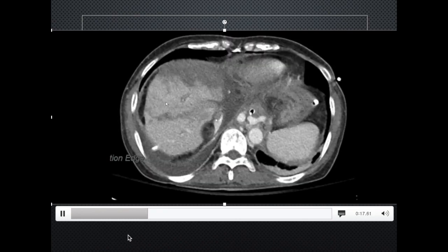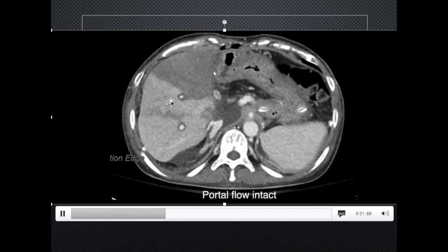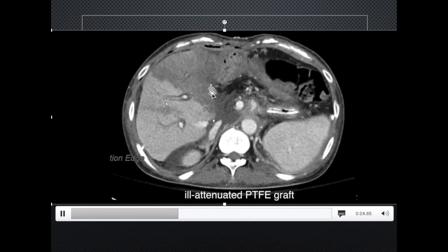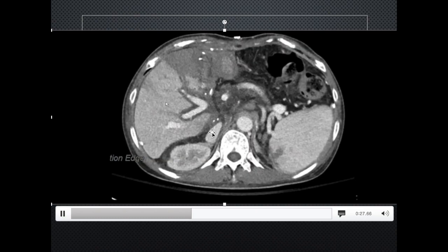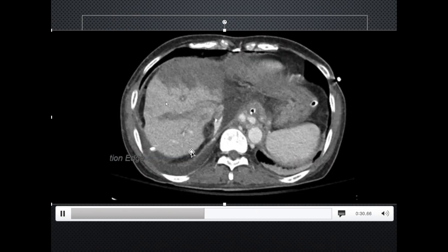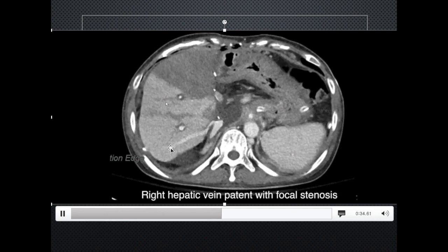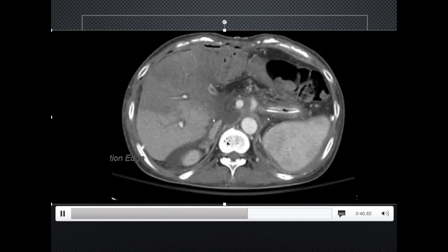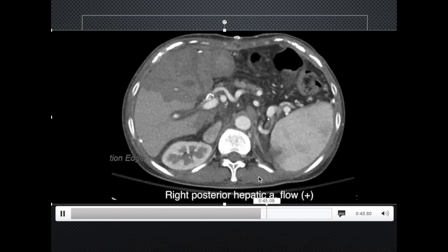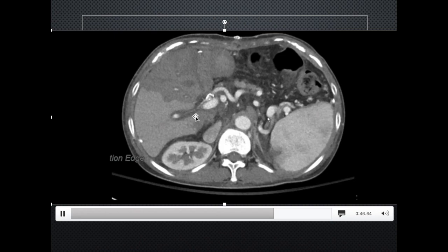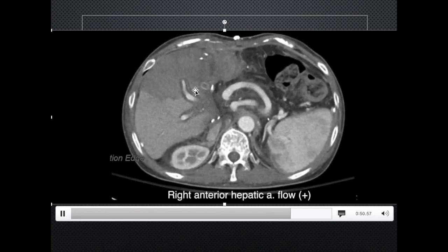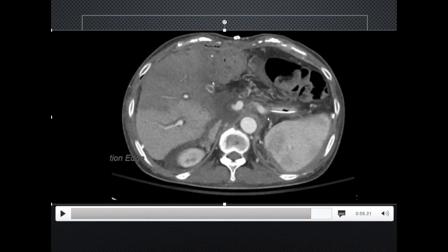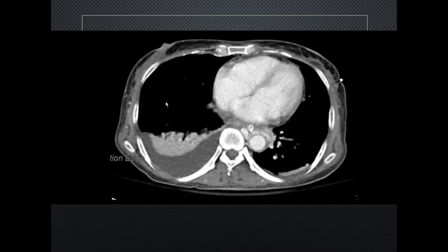Now let's take a look at the vasculature. The portal flow seems okay and intact, but compared to the bright portal flows, the PTFE graft shows ill-defined attenuation. Going up to the hepatic vein, the right hepatic vein shows some patency but there is some stenosis. In the arterial phase, we can see the right posterior hepatic artery — the flow is intact. The anterior one also seems intact. So we can presume that the problem is the hepatic vein. The patient had a stent inserted at the hepatic vein-IVC insertion, and the liver recovered nicely.